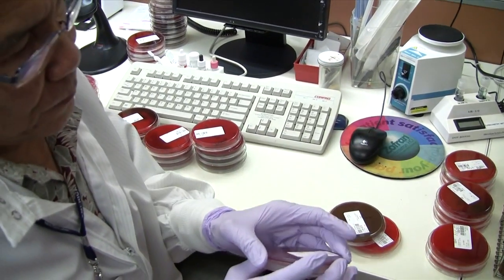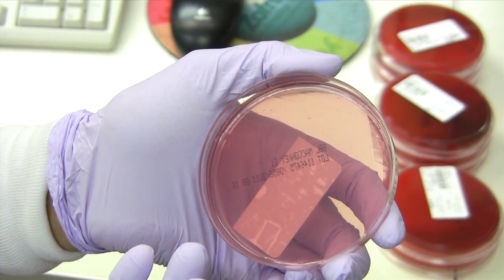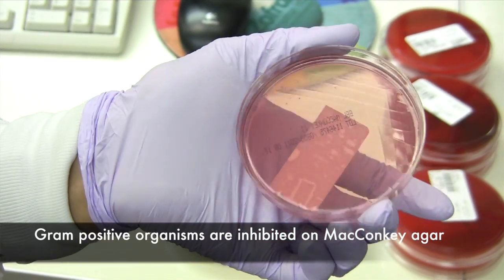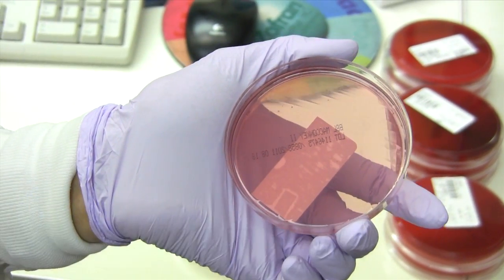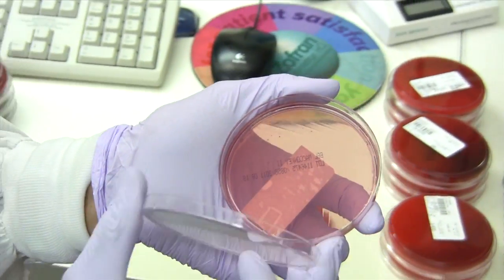The next culture media is MacConkey agar. It does not support the growth of gram-positive organisms, so there's no growth on MacConkey agar.